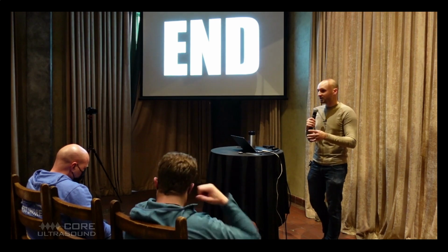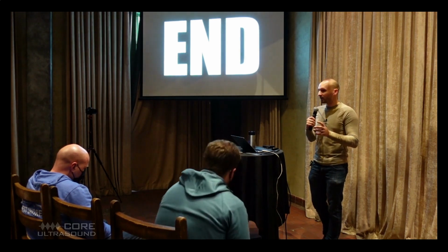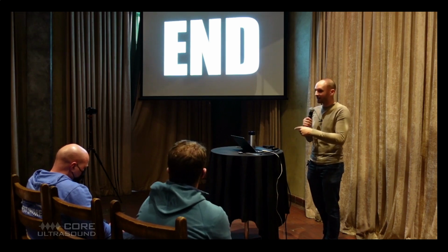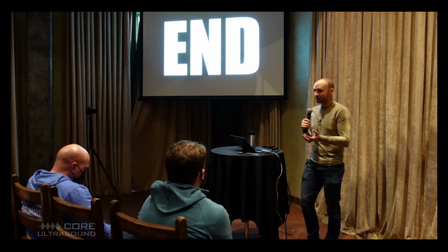Whereas if you see somebody you've never seen before, they have a borderline right heart enlargement, but that wall's thickening, you can for sure use that. But I'm still going to be using the 60-60 sign to see if it's different.